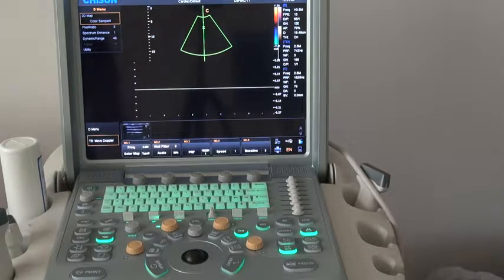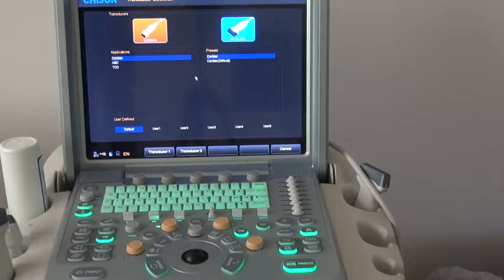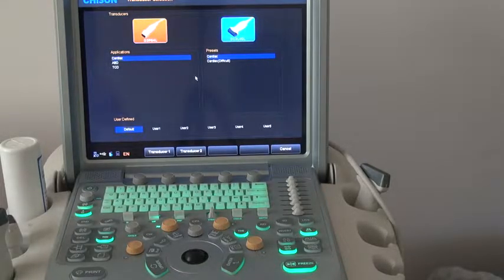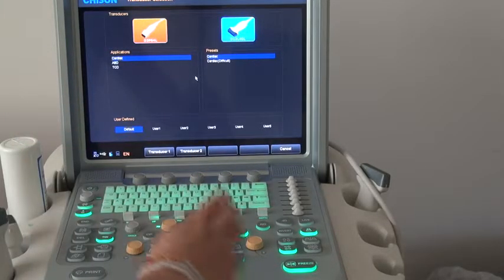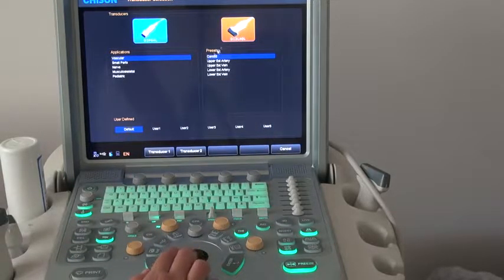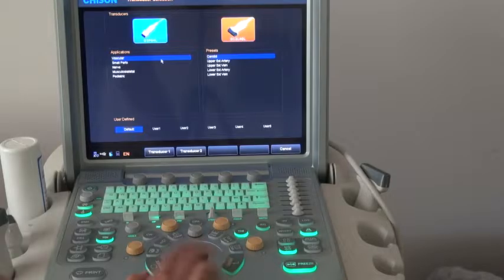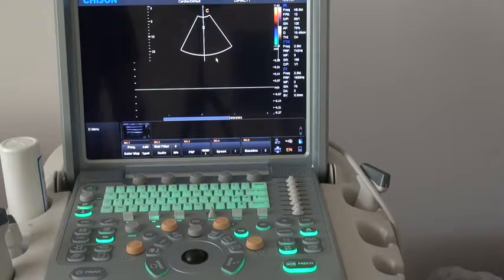That covers the professional cardiac functions. Next, I will show you the general operation for Q9. I will take the high-frequency linear probe as an example. We choose the high-frequency linear probe — its central frequency is 12 MHz. Choose the vascular application and go into B mode.